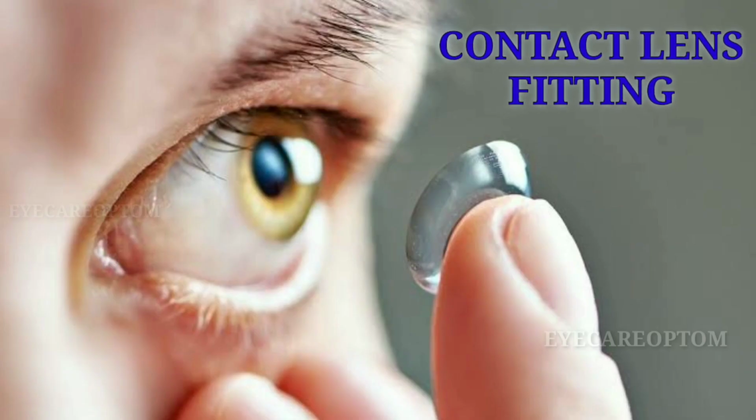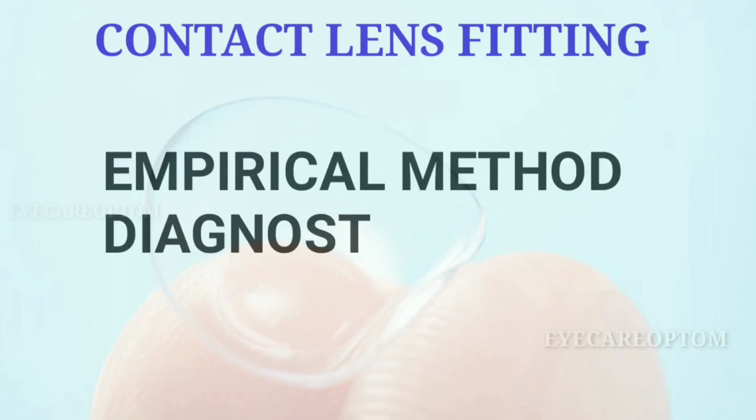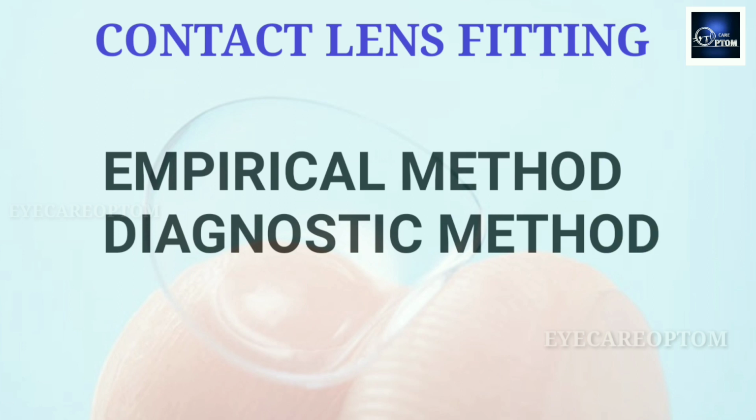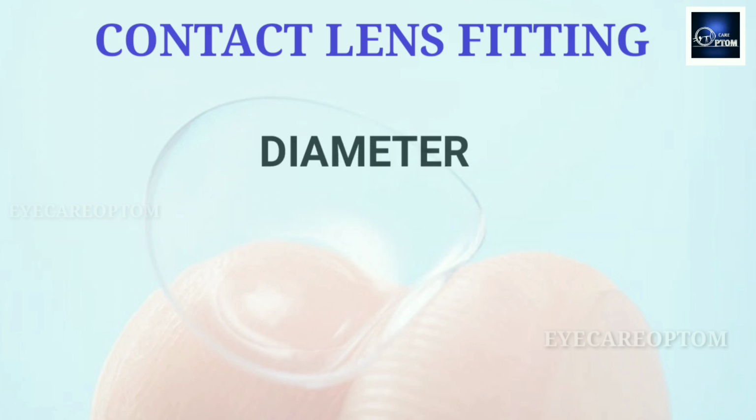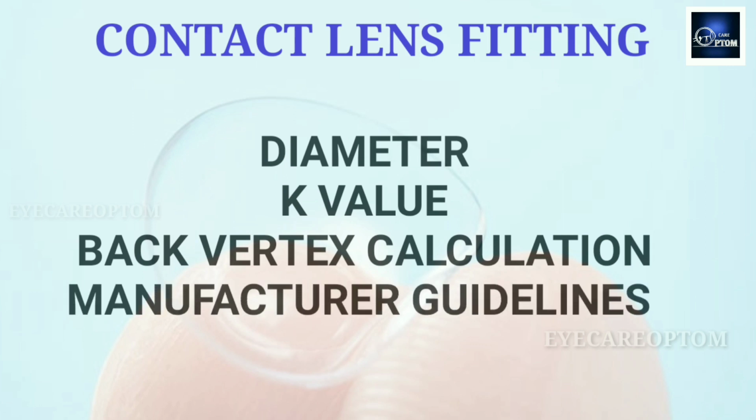Today I'm going to discuss contact lens fitting. When it comes to contact lens fitting, we have two methods. One is empirical fitting, the second one is diagnostic fitting. Both methods are based on total diameter, keratometric reading, back vertex calculation and manufacturer guidelines.